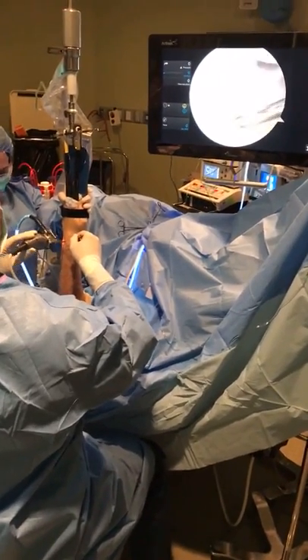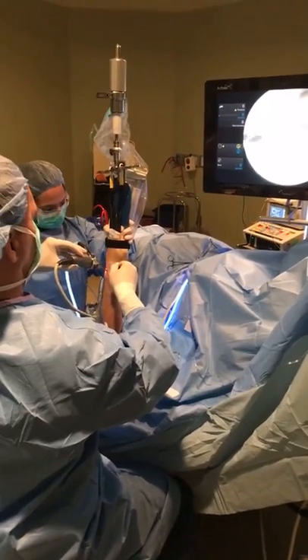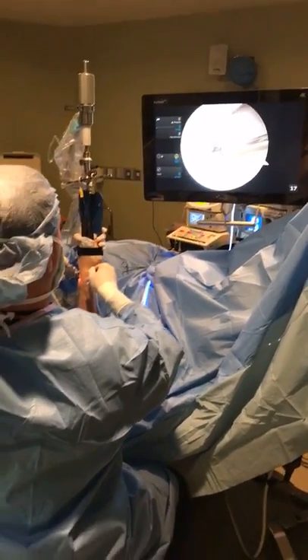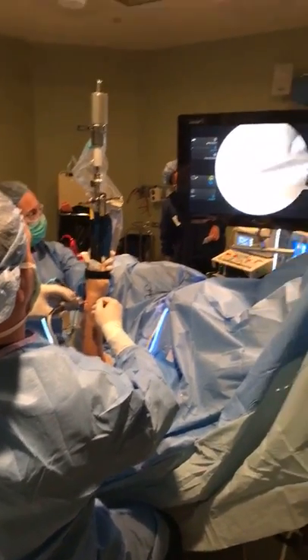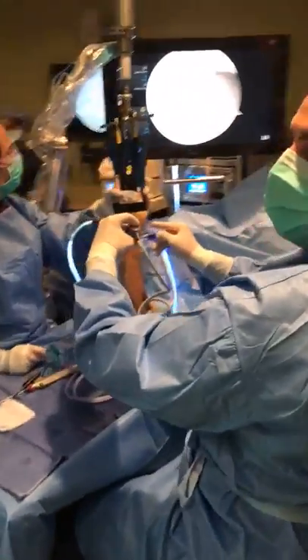So now we don't have any outside sutures or additional holes to fix it. We did it all inside. So now the edge of this cartilage, which had detached, is going to repair to the capsule, and we're going to keep them in this position for about 5 weeks.